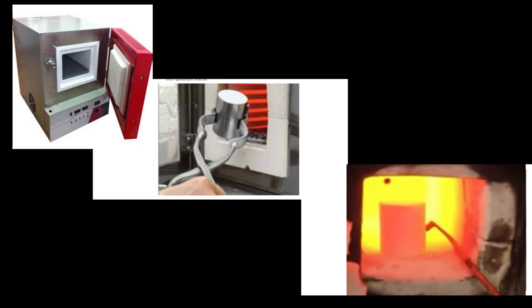In the burnout, the wax inside the mold is vaporized and it leaves an empty space or cavity there. The molten metal will later flow into this cavity.